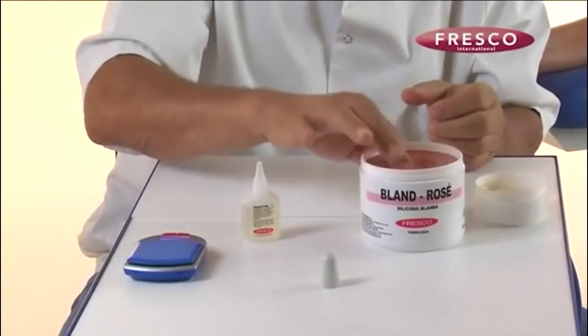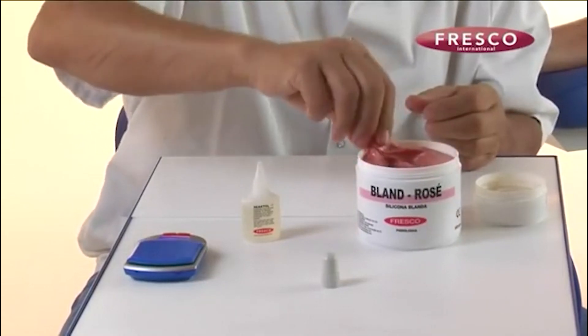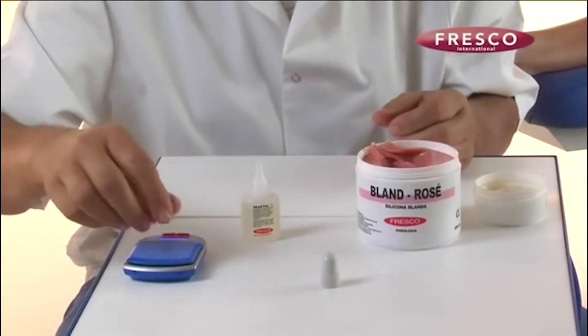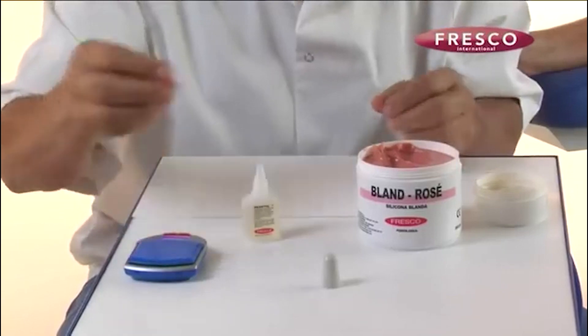Place your fingers in the silicon jar to moisten them before selecting the required quantity of silicon — in this case, bland rose — to make the orthosis. The quantity of silicon to be used is weighed on the scales; in this example, 5 grams.